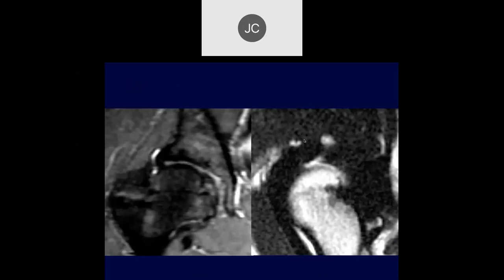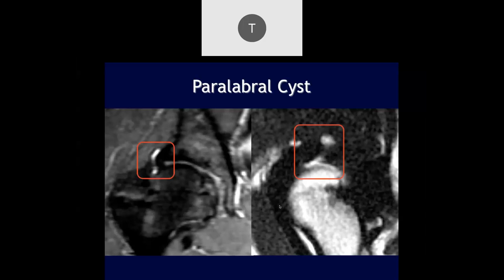Tason — I think there is a tear of the superior labrum with a paralabral cyst, seen better on the sagittal view.